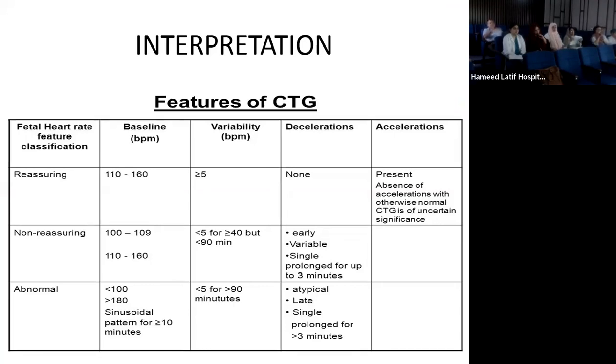Sine is a wave. It's like this. There's no baseline. There is nothing. It reflects the fetal anemia.